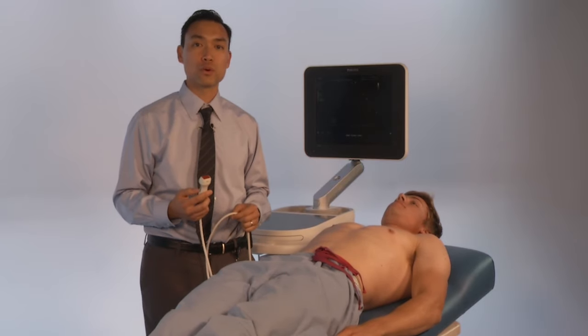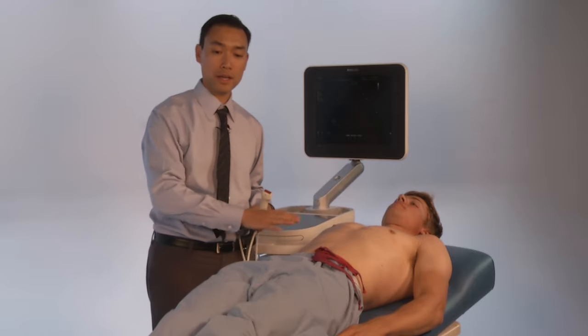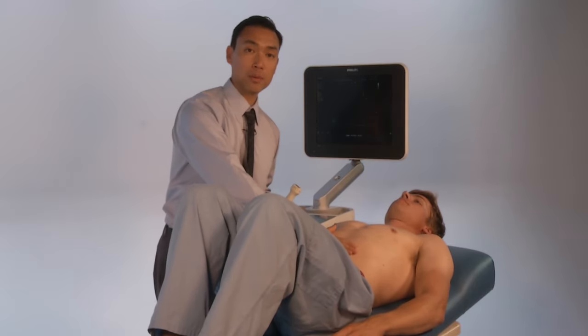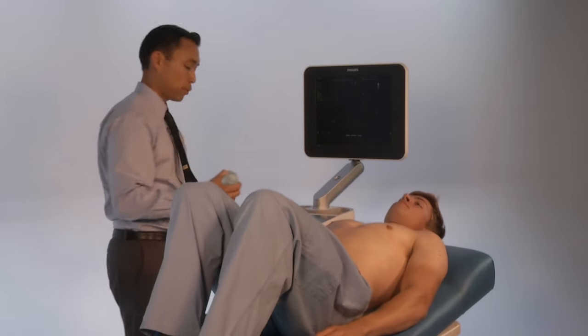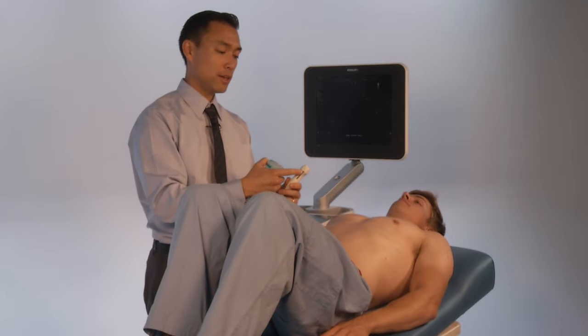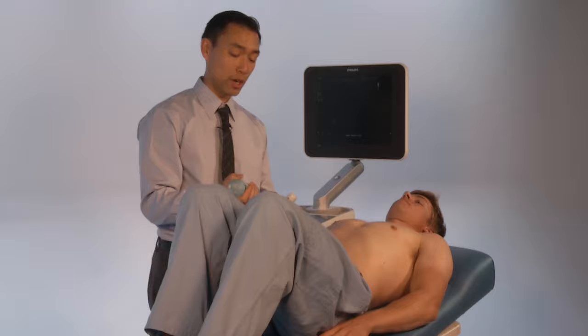This is the sub-xiphoid view for cardiac ultrasound. In this view, we're going to have the patient supine. The legs are going to be bent to release and relax the abdominal muscles. We're using a phased array transducer, and the indicator is going to be towards the patient's left side when you're in cardiac mode.